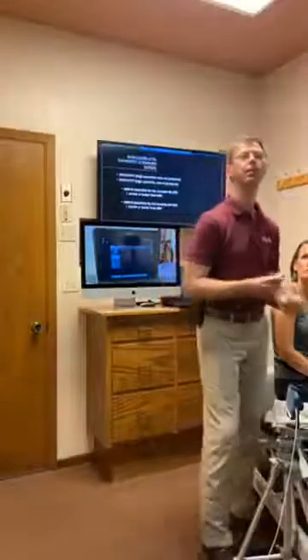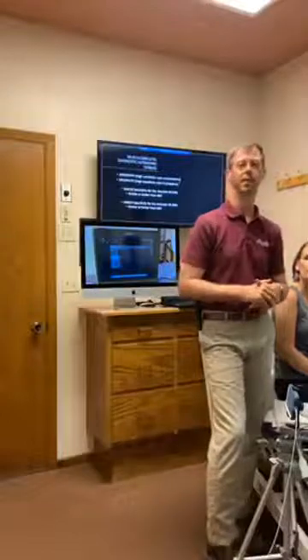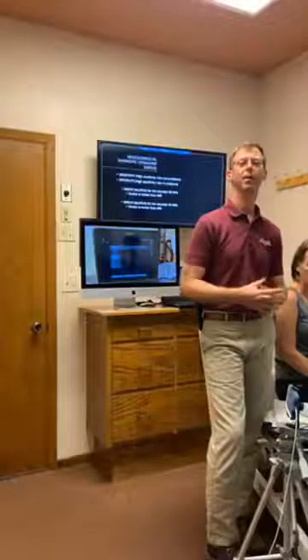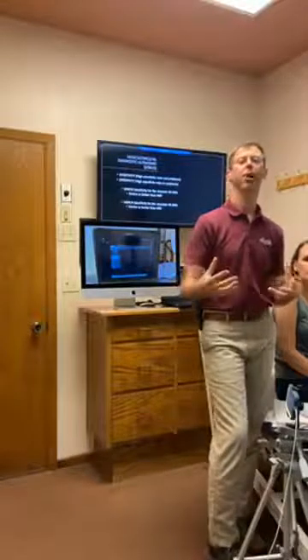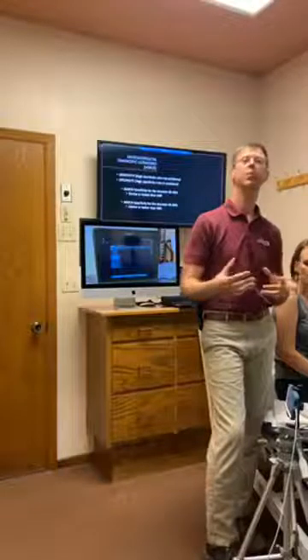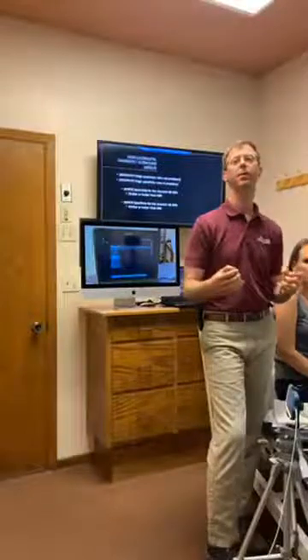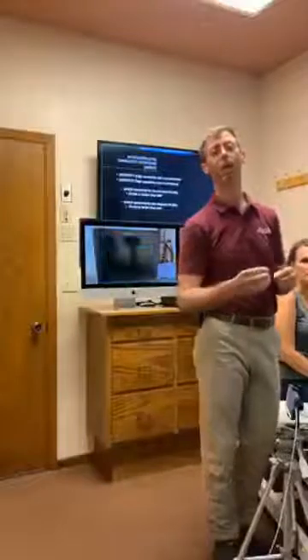So when we're talking about diagnostic musculoskeletal ultrasound, we need to know a couple different terms. One is specificity and one is sensitivity. Sensitivity is important because when you're looking at any diagnostic tool, the greater the sensitivity, the greater the ability to rule out a problem that you're using that tool for. Specificity looks at the ability to rule in a problem. So a higher specificity has a greater likelihood of ruling in a problem.